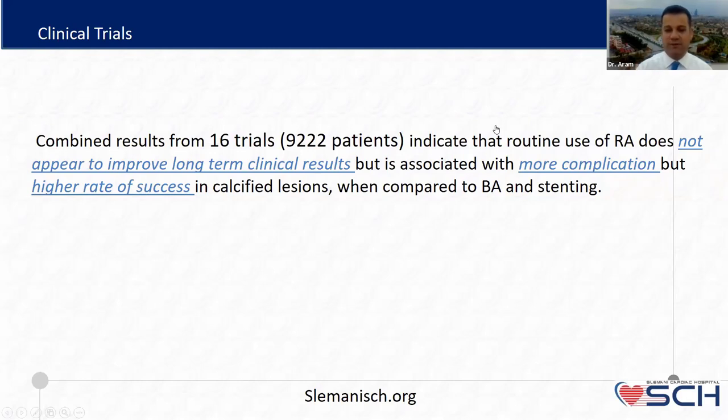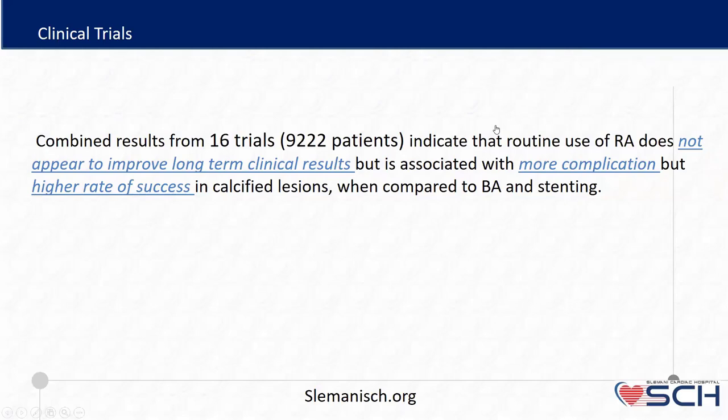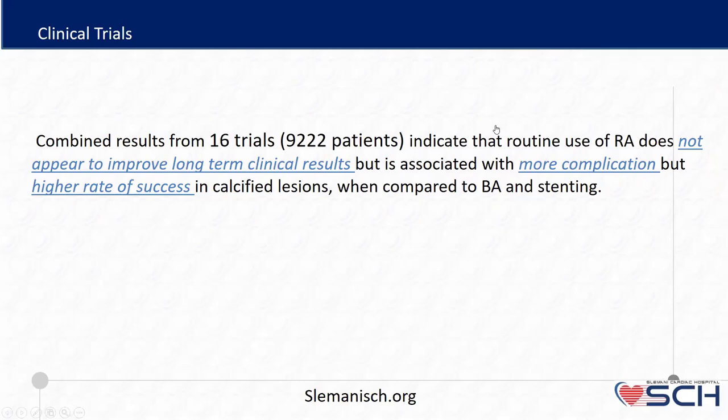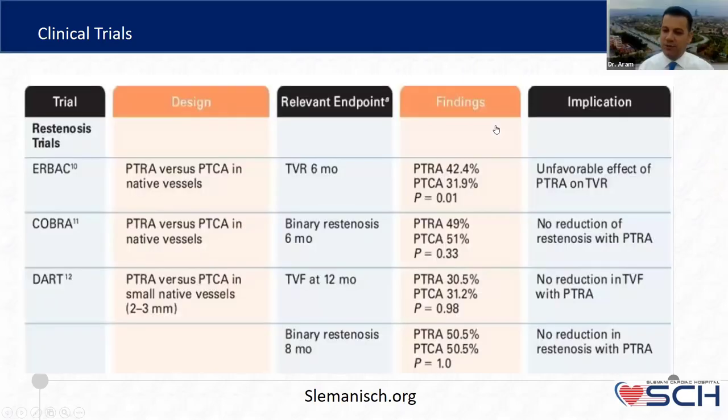So the only rationale for using the rotablator is that it will increase your rate of success at the expense of complications, radiation, and, I don't know, cost, because if you have a bulk of patients, definitely it will be costly. But also do not forget, I'm sure all of us have faced a patient, not only one, where we used several balloons without any benefit. A rotablator will add some cost and will not affect any future TLR or restenosis, but it will increase the success of your procedure.